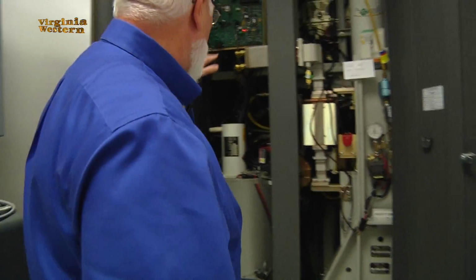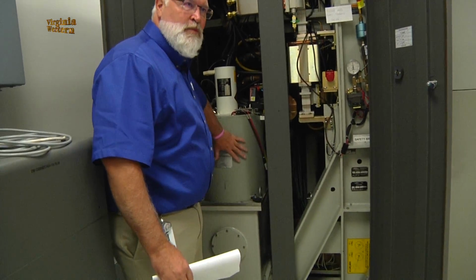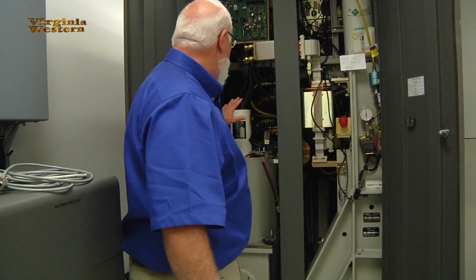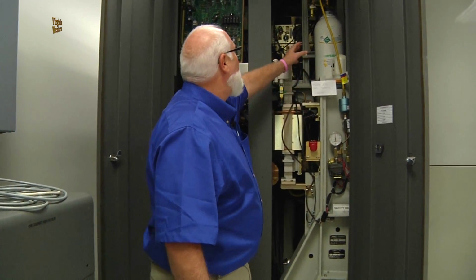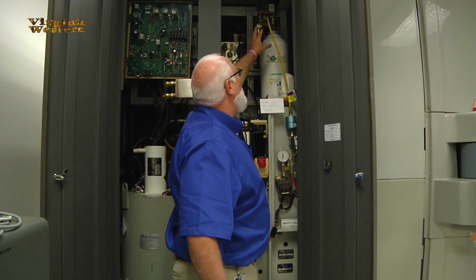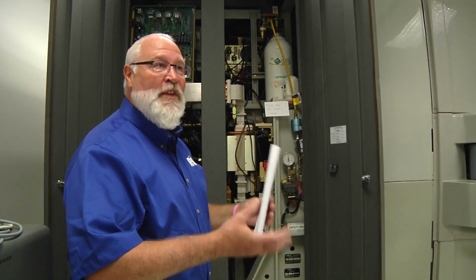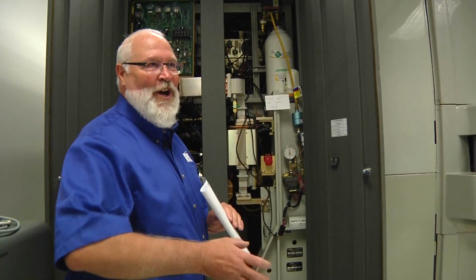This is your Klystron, and I have the power supply turned off, but a lot of times this will be really hot. It'll be hot to touch. Won't be hot enough to burn you, but it will be hot to touch. See this little note here from your varian engineer? This is your SF6 tank. And usually you're going to have a couple knobs here. This one's a newer style. Usually I have a great big black knob and everyone thinks that's the knob to open the tank to fill up to your gas level. Well, that's actually a regulator knob.